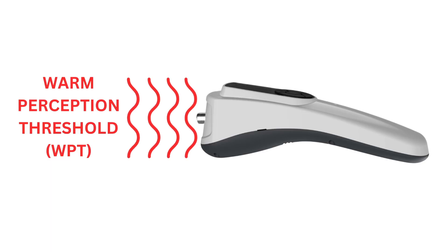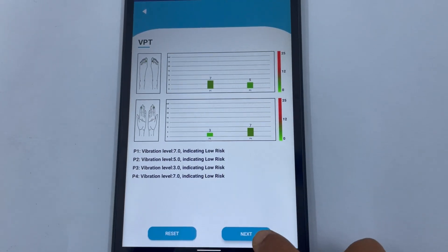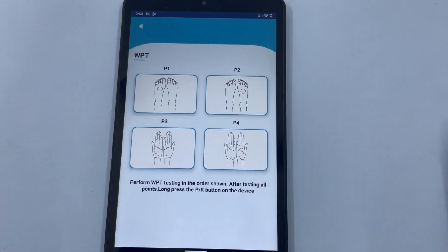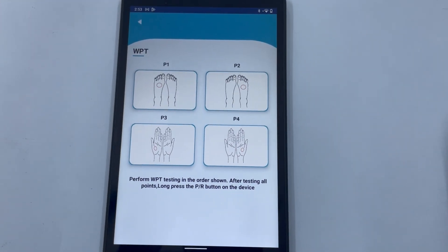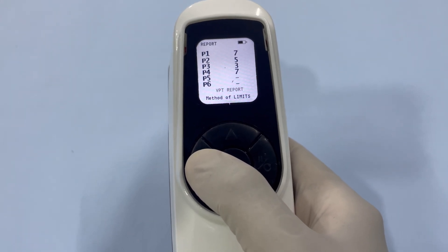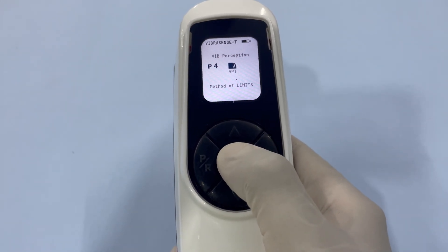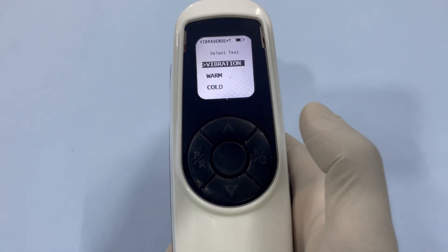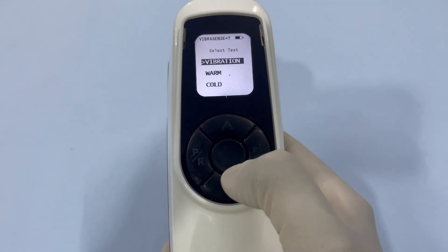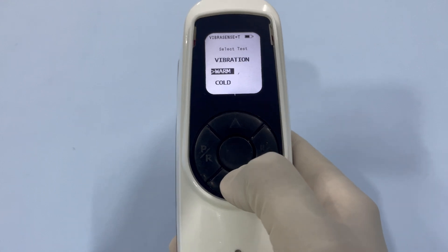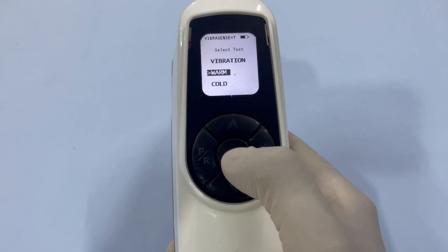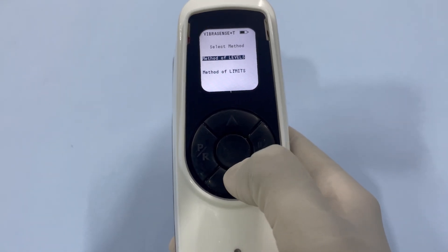Warm Perception Threshold test. Press the Next button below this report on the app screen. This will take you to the next test screen. On the device, first single press the PR button once, then long press the center button to go to the home screen, with the previous test conducted highlighted. Use the up or down arrows to highlight the warm test and click the center button to select it.